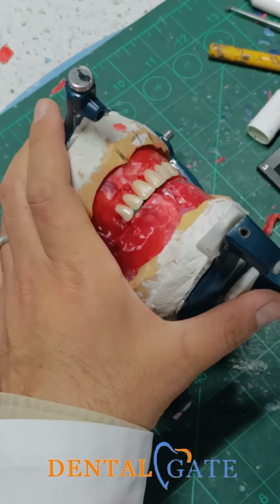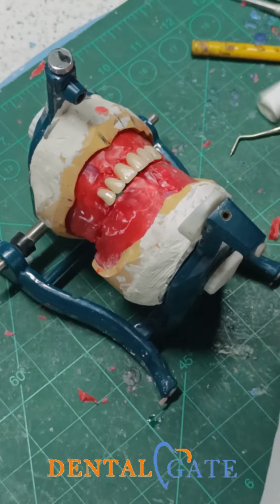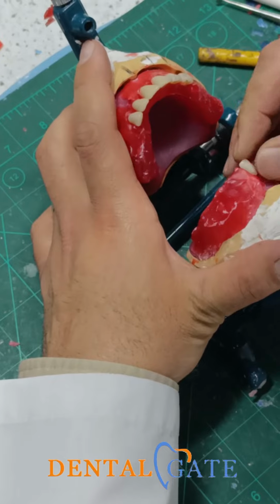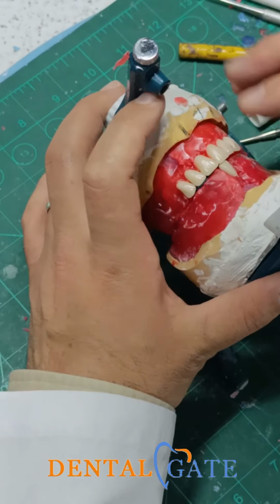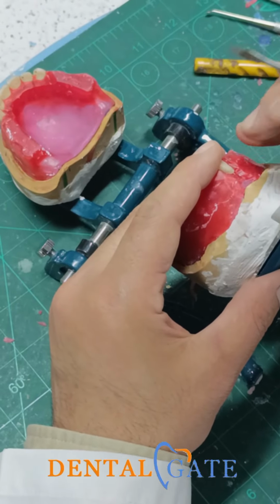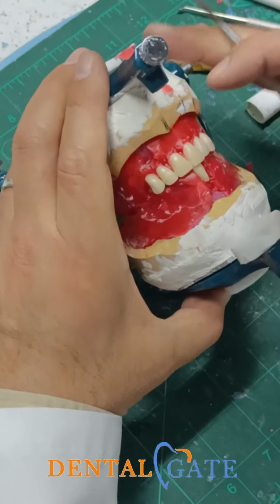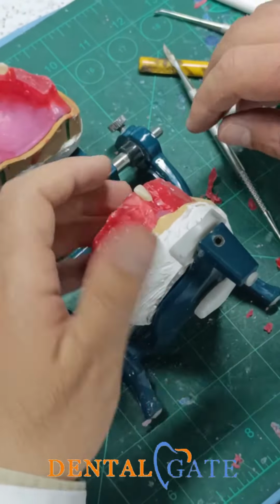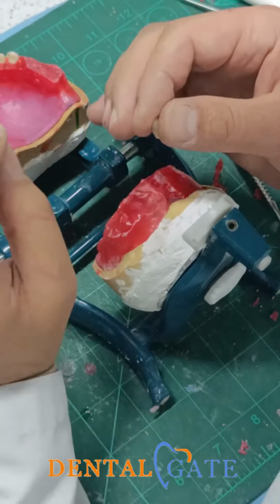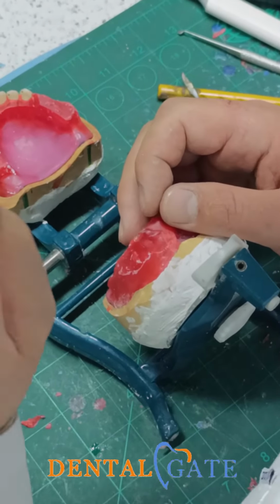For the first lower teeth, I will evaluate the midline. Just put it here in the proper position to evaluate the midline. So the midline seems good. Make another deviation in the lower teeth to make the midline more correct. Now this is the position of your tooth, okay? Now what I need is to place the central incisor in the proper position, in accordance with the criteria.